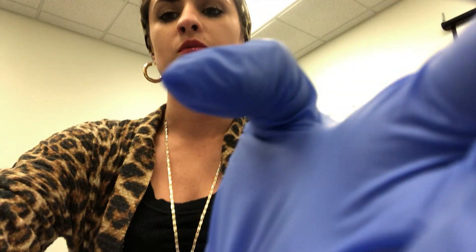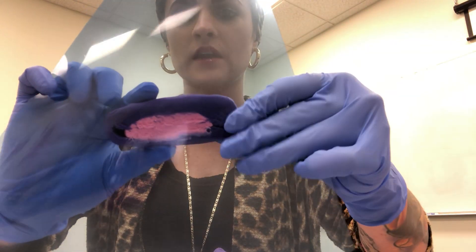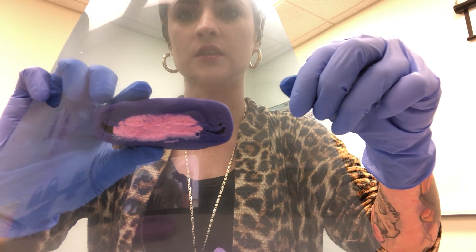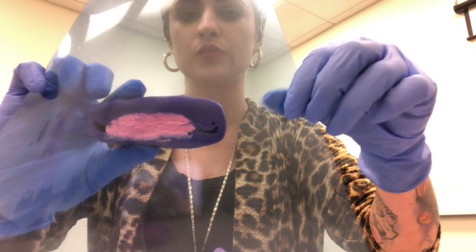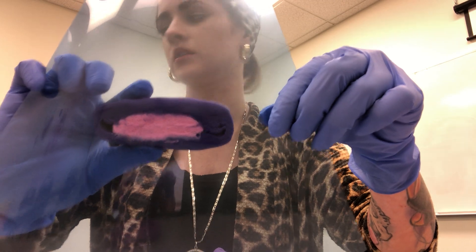The reason we get it nice and elongated is for measurement purposes of the kidneys. A lot of pathologies are demonstrated via measuring - we want to make sure the left kidney and the right kidney are within one centimeter of each other. We want that nice long axis from the superior pole to inferior pole so we can go through and measure it for comparison purposes, ensuring we have an accurate measurement for follow-up exams or for comparing to the contralateral kidney.